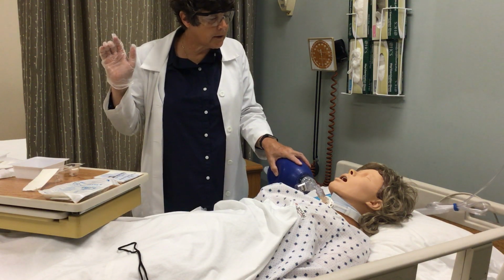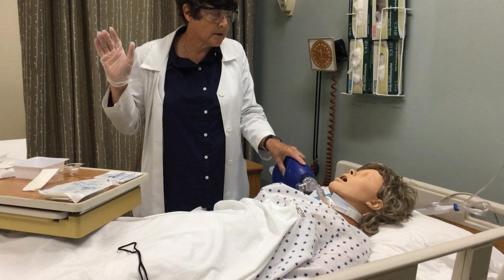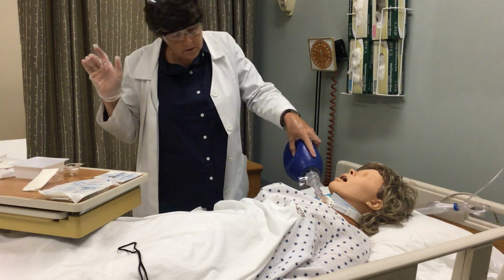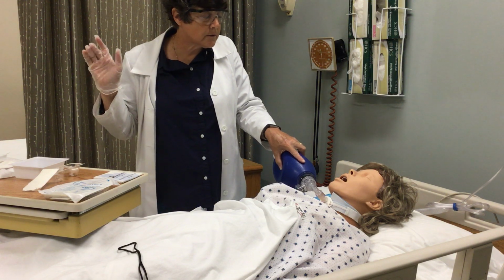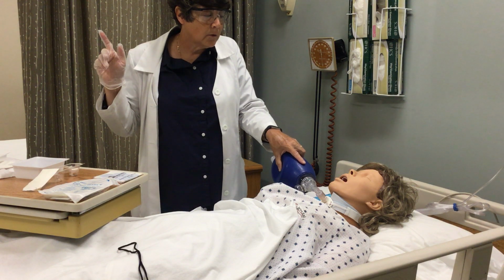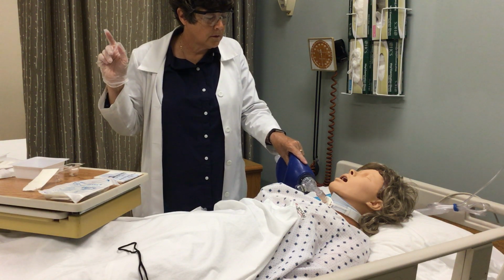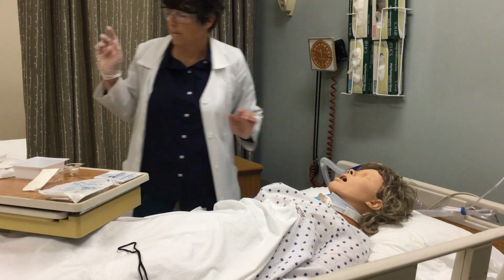And you palm it like a basketball. When they inhale, you squeeze the bag. When they exhale, you release. You do this about 2 or 3 times. Make sure you keep that on there. Don't be rough though, because if it's a new tracheostomy tube, it can be a little bit sensitive. While I'm doing this, I'm also watching the pulse ox to make sure her O2 sat is sufficient. Okay. And take that off and you set that nearby.